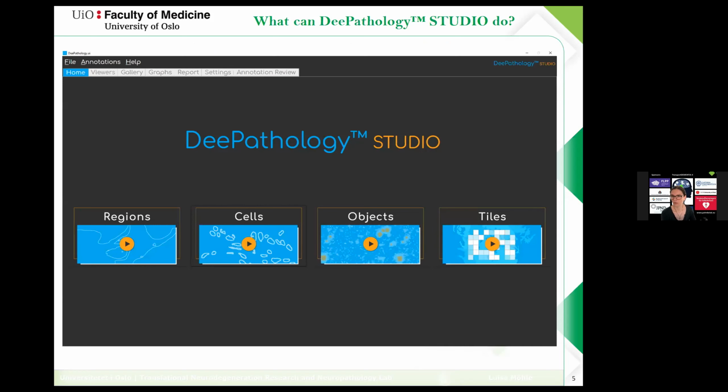So a little bit more about the specific software that we're using. As I said, it's called DeePathology STUDIO, and it has a wide variety of modes. You have the regions mode, where you can basically separate and segment a slide into different regions that have a different cell concentration or a different structure in general. You can use the cells mode to quickly identify different types of cells.